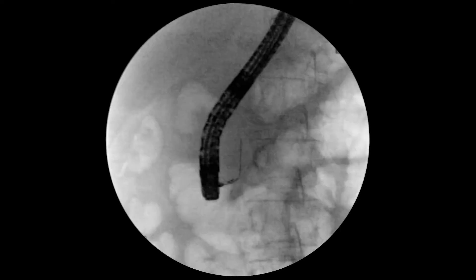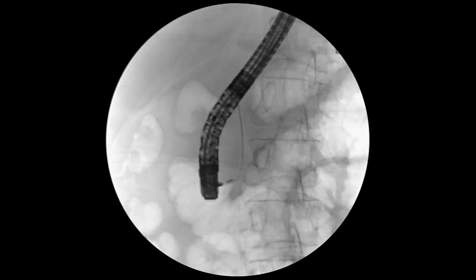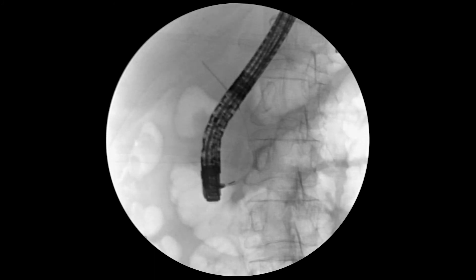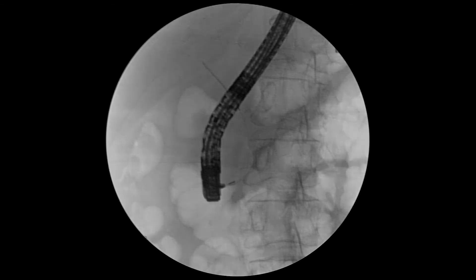So if we see a guide wire going straight up towards the liver even before contrast injection, we can surmise that this is within the bile duct.